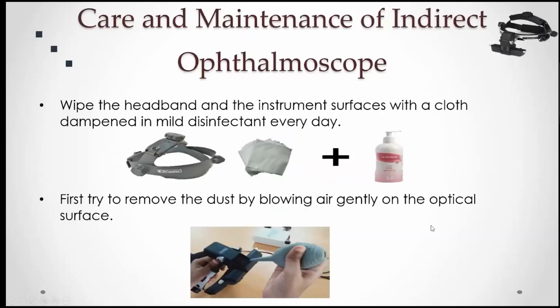So let us move on to the care and maintenance part. Since it has the headband, disinfecting it is very important. So wipe the headband and the other instrument surfaces using rubbing alcohol with a slightly moist cloth every day, and try to remove the dust.